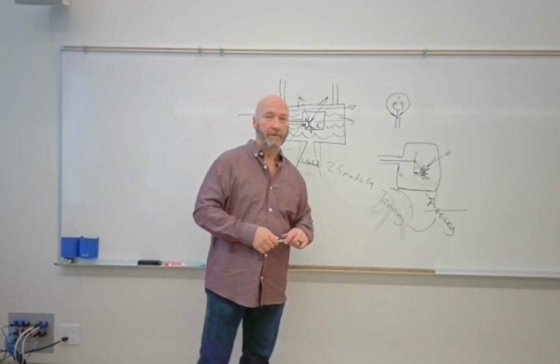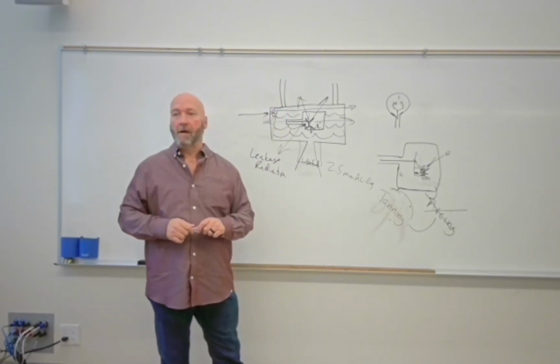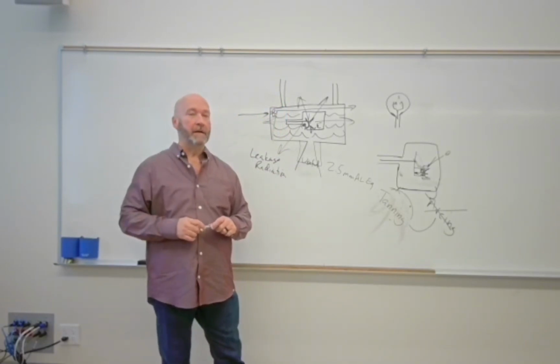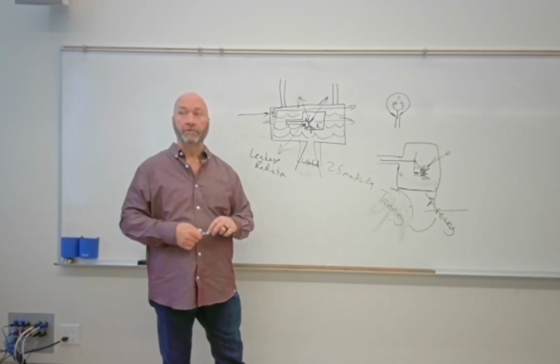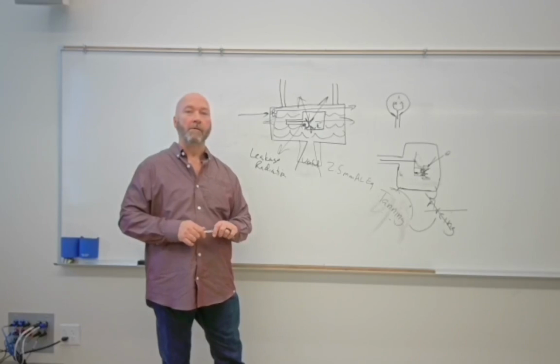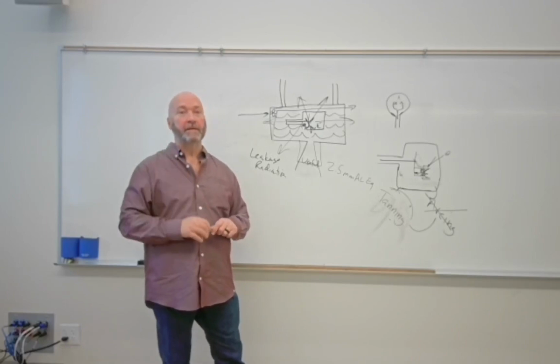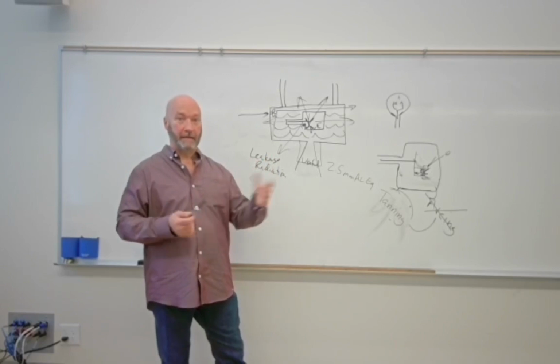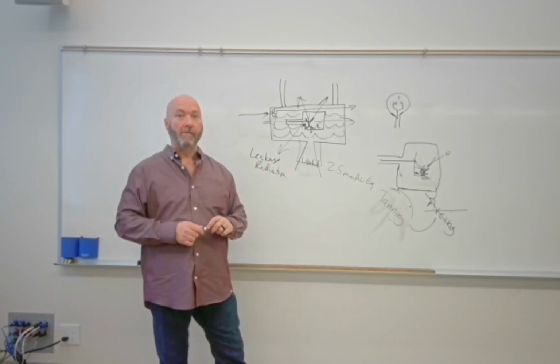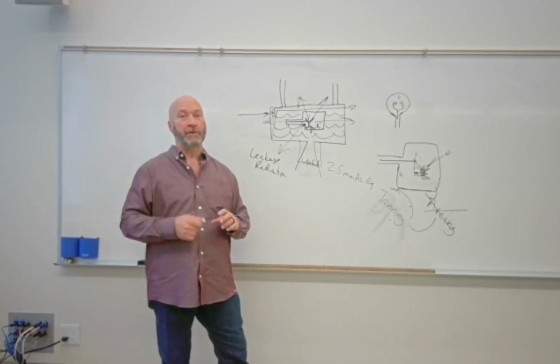The problem with tungsten, though: has anybody ever dealt with tungsten? Welding, TIG welding or anything like that? Anybody got a tungsten ring? Because that's been kind of a thing in the last few years. Nobody has a tungsten ring. Your husband does. Okay, tell him to be careful with it. If it's pure tungsten, it's fragile. Chances are it's an alloy, because if it is pure tungsten and he's dropped it, chances are it's shattered.